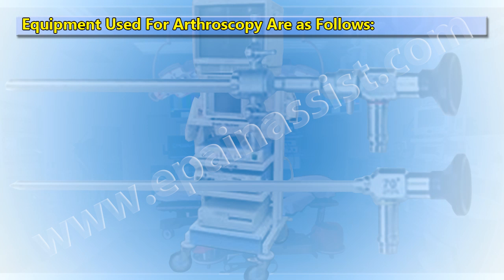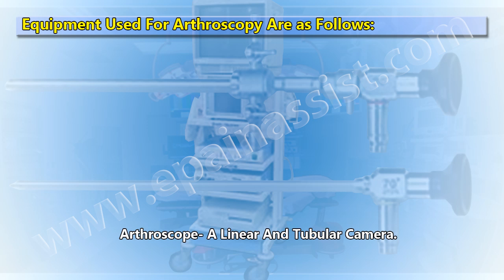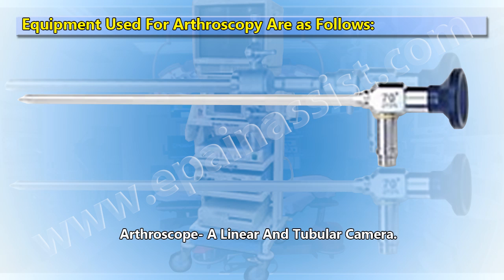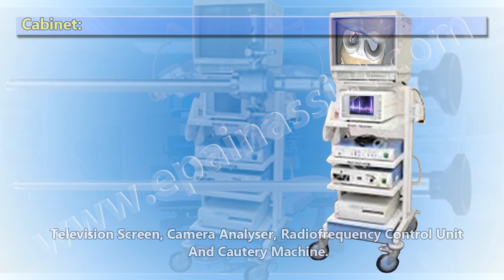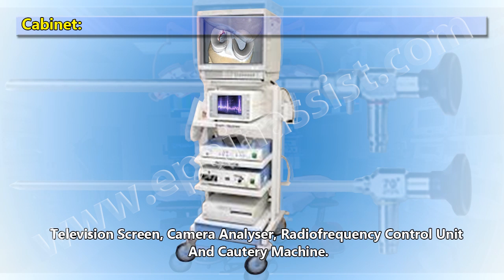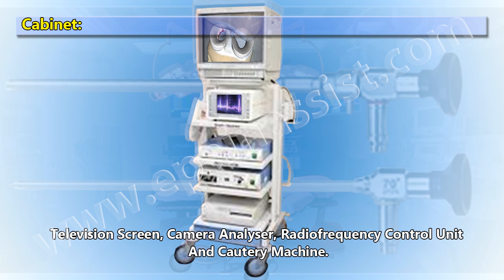Equipment used for arthroscopy includes: an arthroscope, a linear and tubular camera, a cabinet, a television screen, a camera analyzer, a radio frequency control unit, and a cautery machine.